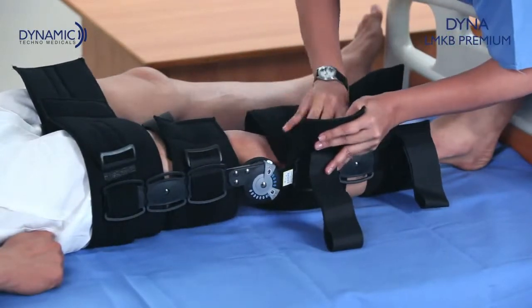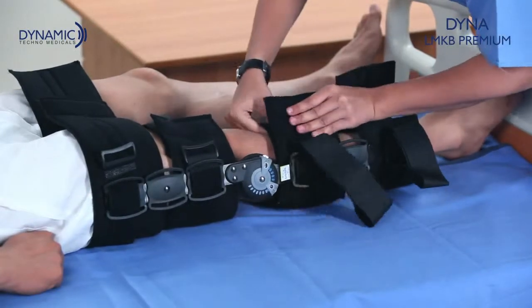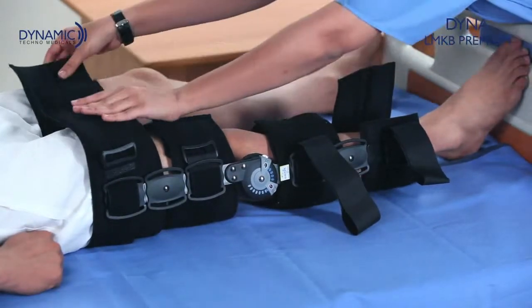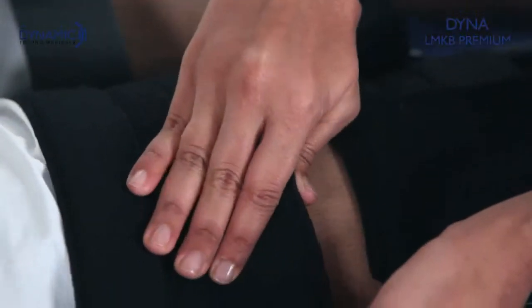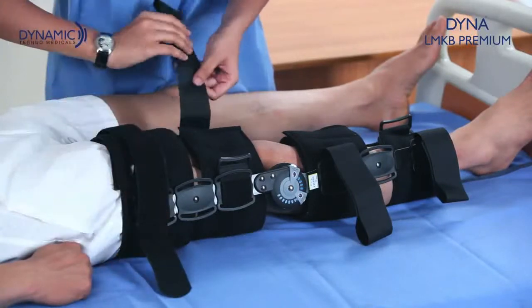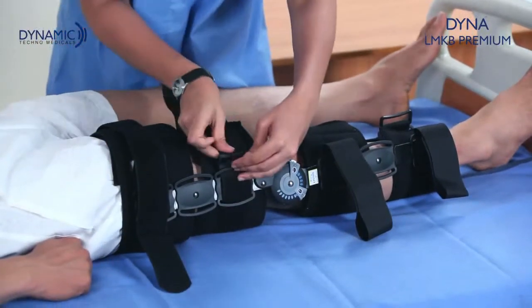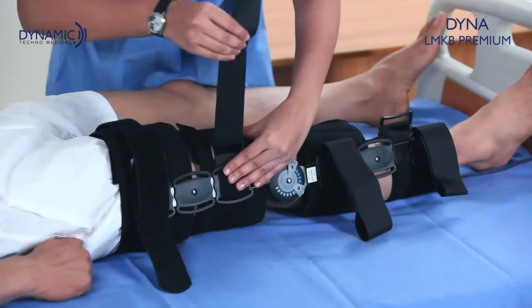Fasten first the lower thigh band just above the knee and the upper calf band just below the knee. Then strap the upper thigh band and lower calf band. After tightening the thigh and calf bands, fasten the Velcro straps in the same order.